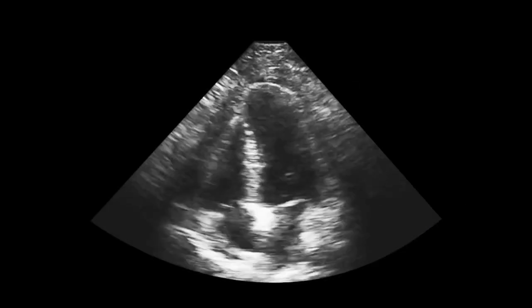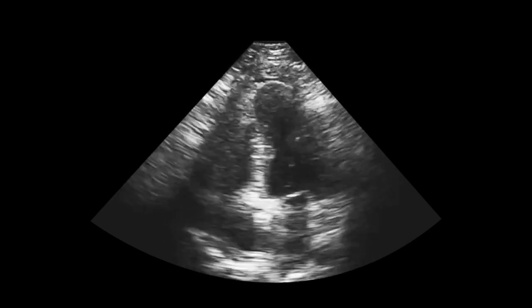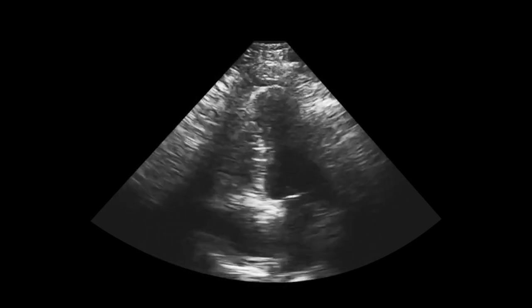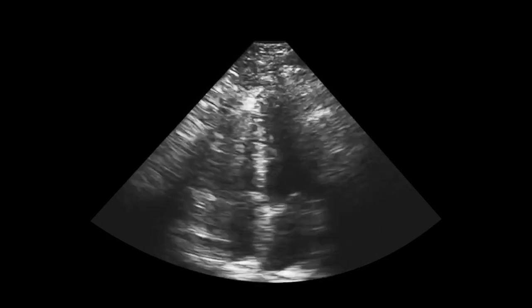The next view is the apical four-chamber, where you can see definitely some more ventricular dysfunction towards the apex. And ultimately, we wound up transferring this kid down to Children's Hospital down south for a possible ECMO and potential heart transplant.